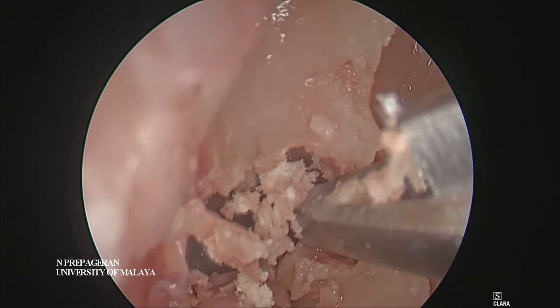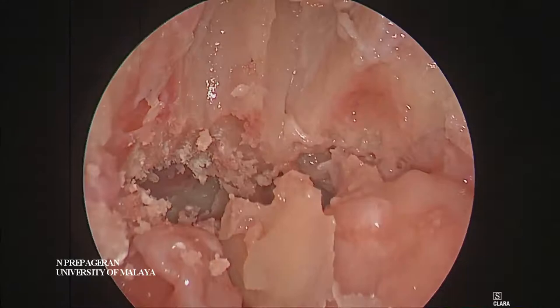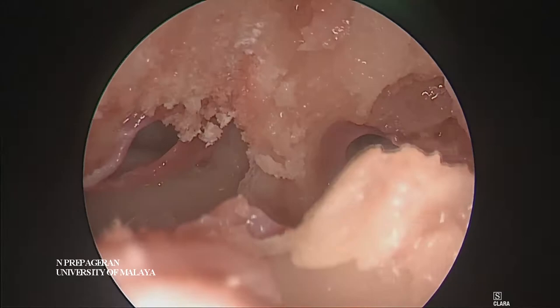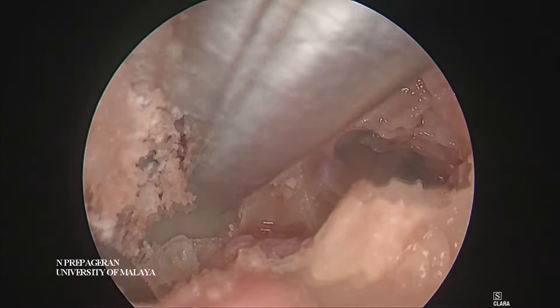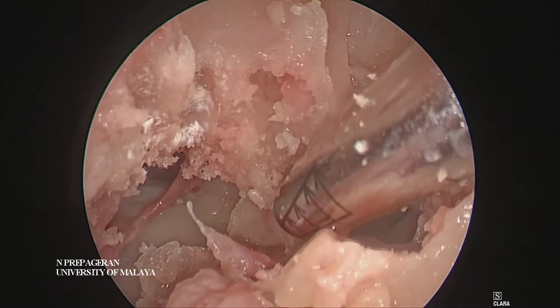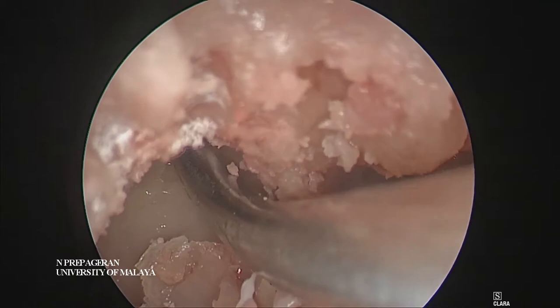The advantage if you can do a Lothrop with a Kerrison punch is that it will not stenose as much. I'm going to use Kerrison until I cannot use Kerrison. I'm not saying don't use a drill — you can use Kerrison if you don't have a drill, but obviously with a drill you will be able to remove more. That's the frontal sinus. Let's drill. And frontal sinus on the opposite side as well.